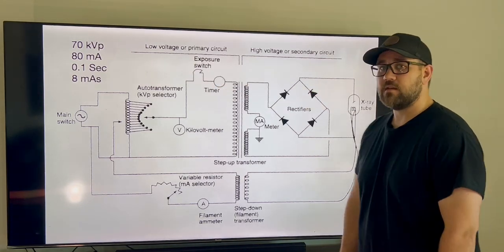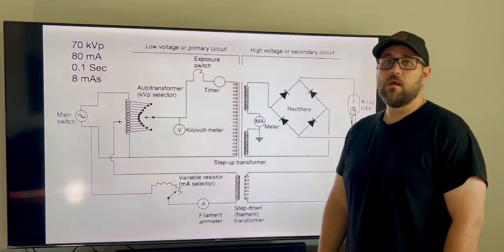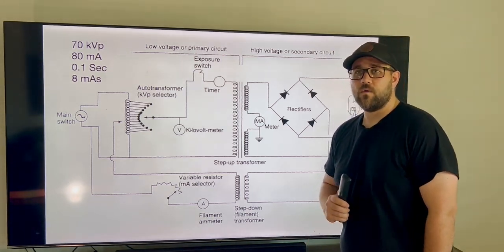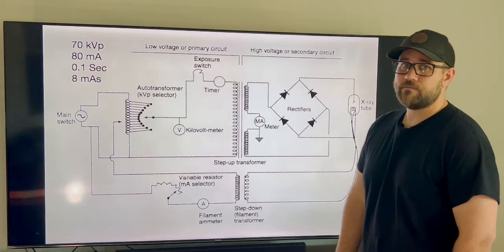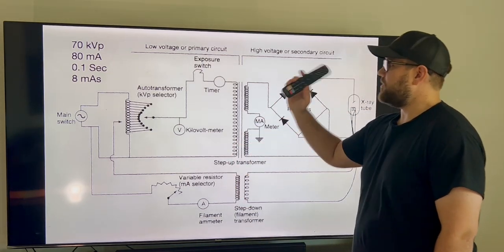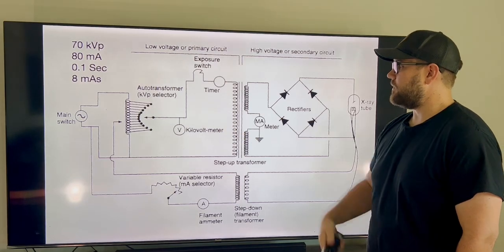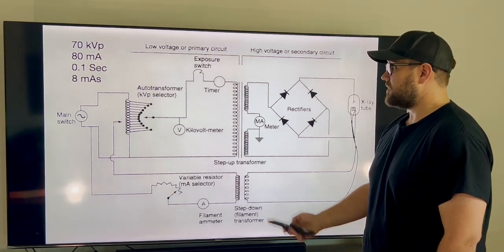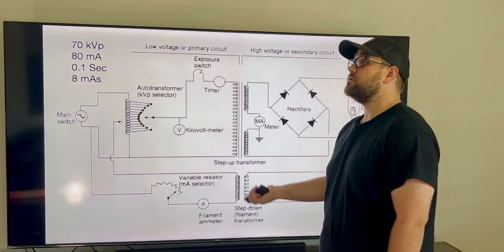Our technique that I'm going to be using today will be 70 kVp, 80 mA, 0.1 seconds, which in turn will be 8 mAs. Okay, so let's put that into our control panel for our x-ray, and then we'll start talking about what will start happening.